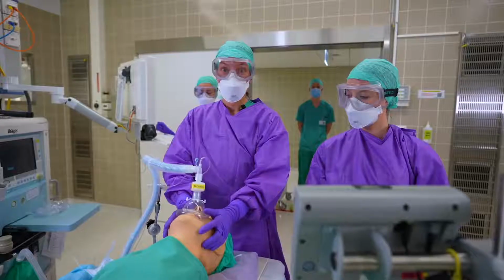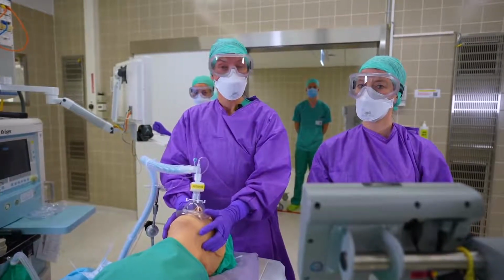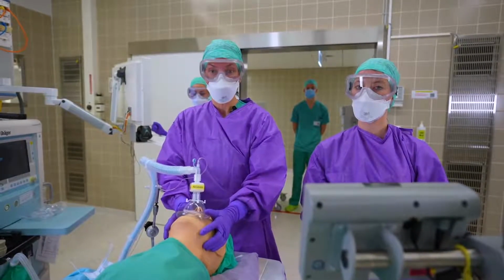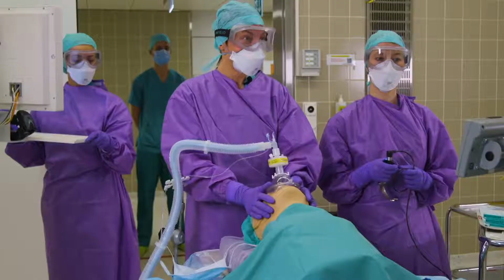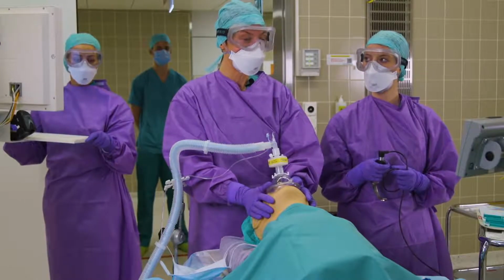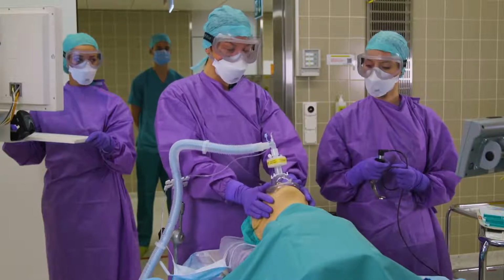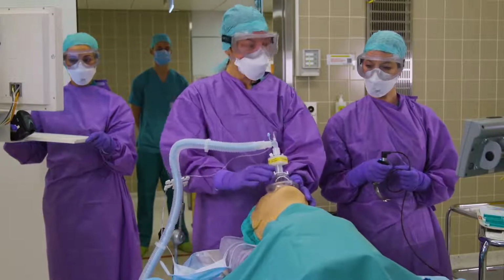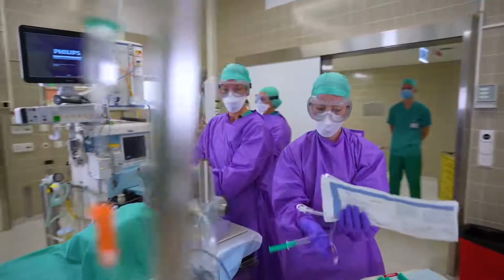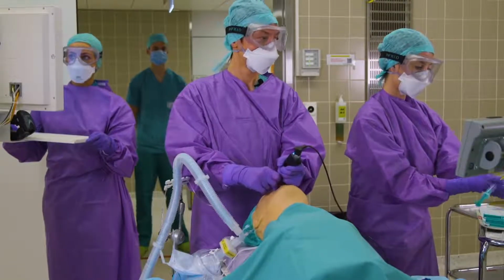After a thorough pre-oxygenation, we are starting our rapid sequence induction. RSI is used to avoid backmasking the patient for prevention of aerosolization. Here, avoiding coughing with a thorough relaxation is also of utmost importance. We induce the patient and our patient is paralyzed. We are now intubating the patient with a video laryngoscope. We are utilizing an endotracheal tube with a stylet in place.